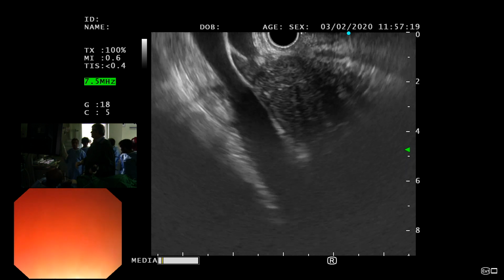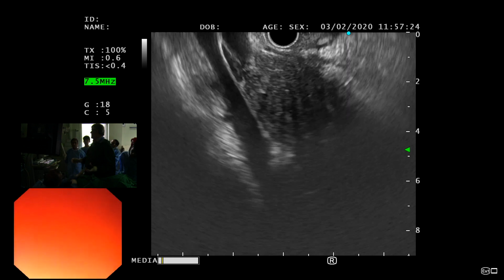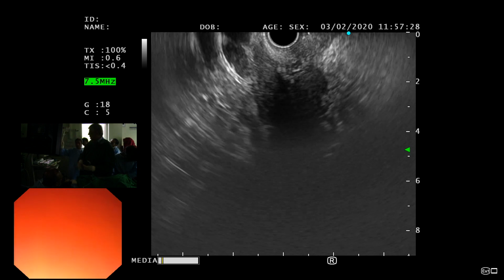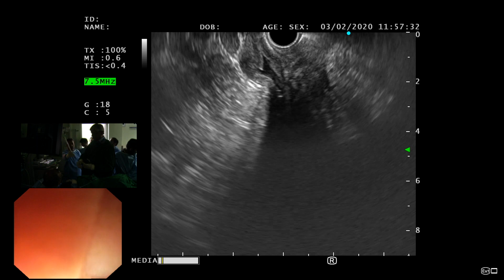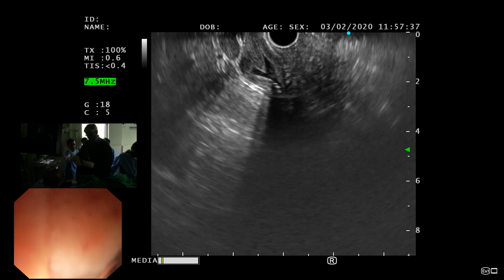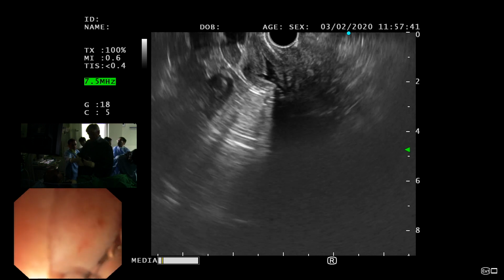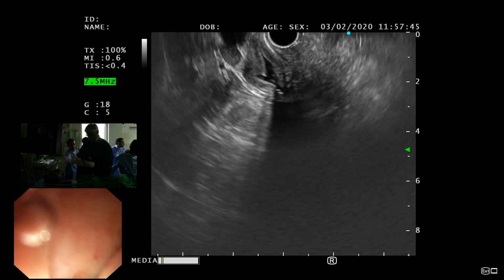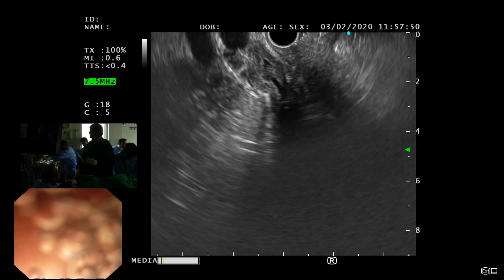Yeah, I see that. And by the way, there is a gastroduodenal artery, I can see it. Especially with the core needle, we need to try to avoid the gastroduodenal. I think it's usually okay even if you get through that, but don't keep going back and forth through the same. The artery is usually forgiving as compared to a vein, because an artery can spasm and bleeding can stop.